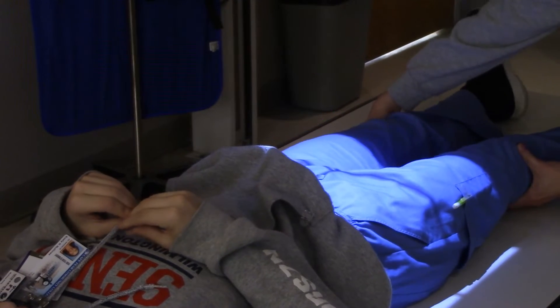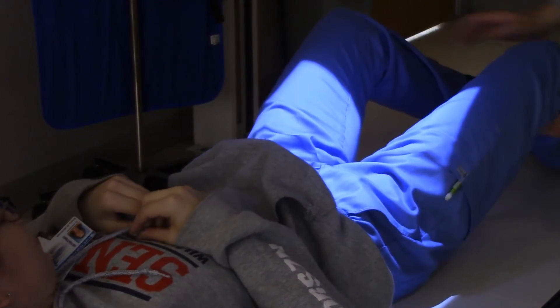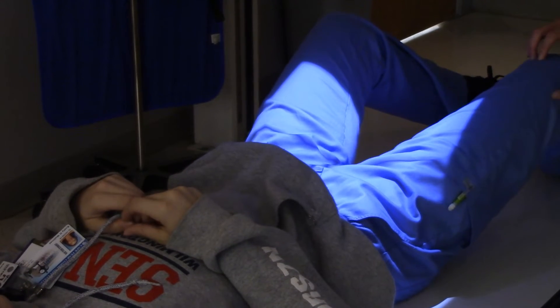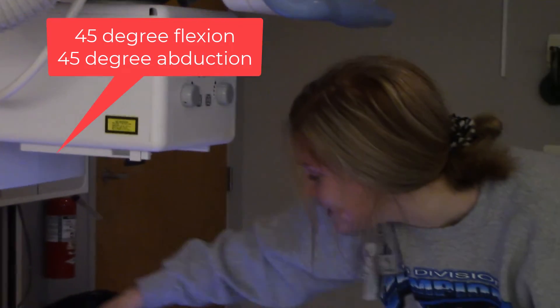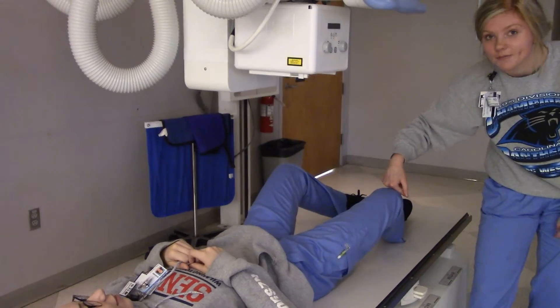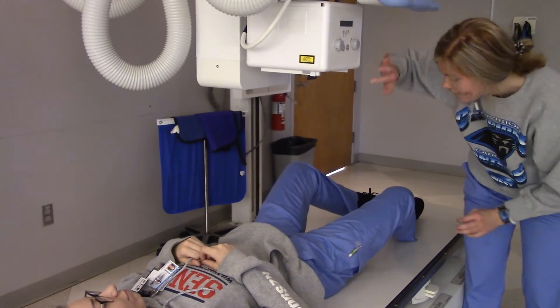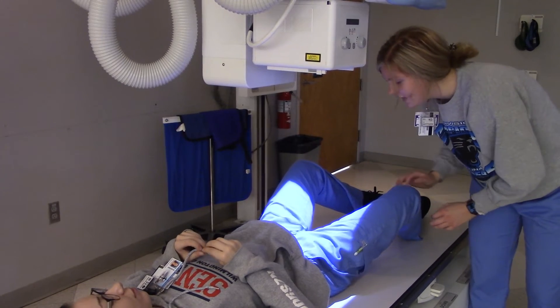Now I'm going to have her pick her legs up and roll them out a little bit. And a good check that Mr. Lee taught us: you want the light field right here in this corner to point towards the knee. And I think we're pretty good.